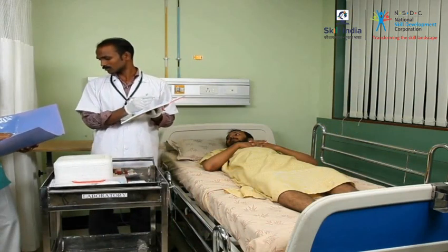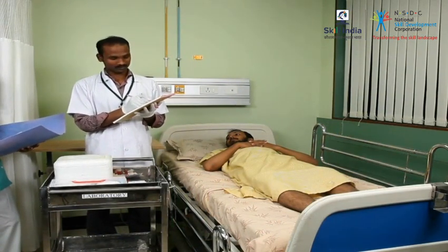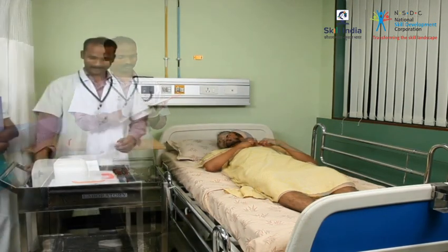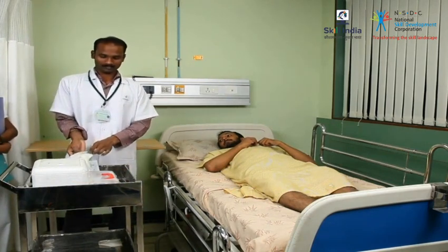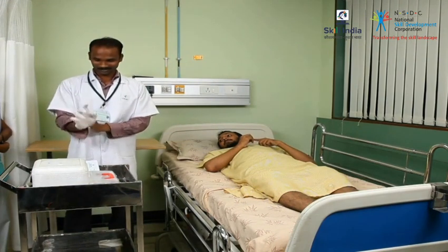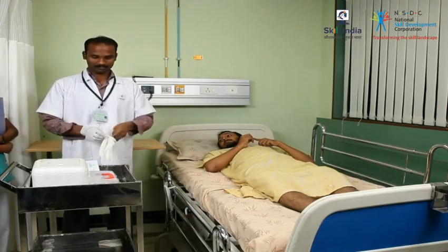The patient's identification must be verified before drawing a blood specimen. Universal precautions such as wearing gloves must be followed while performing a procedure involving the collection of blood or any fluids.